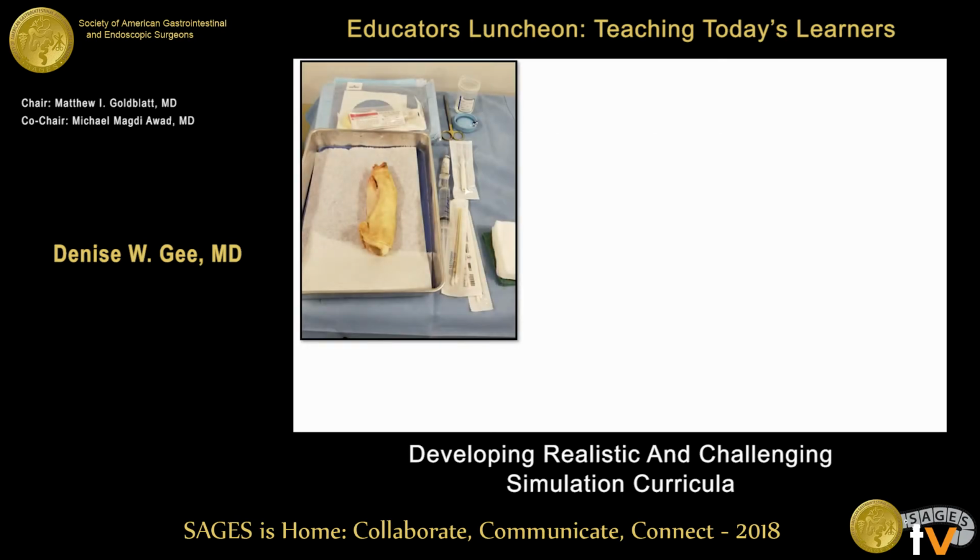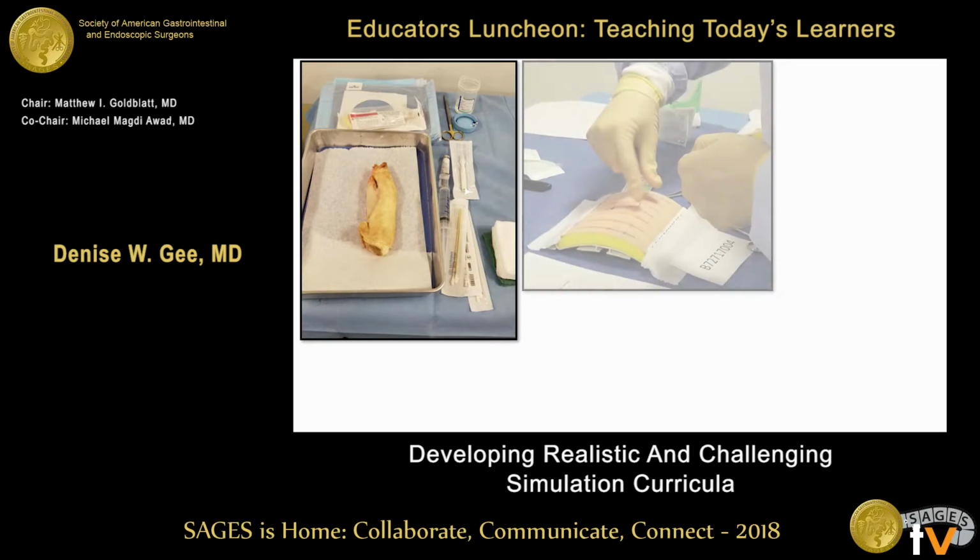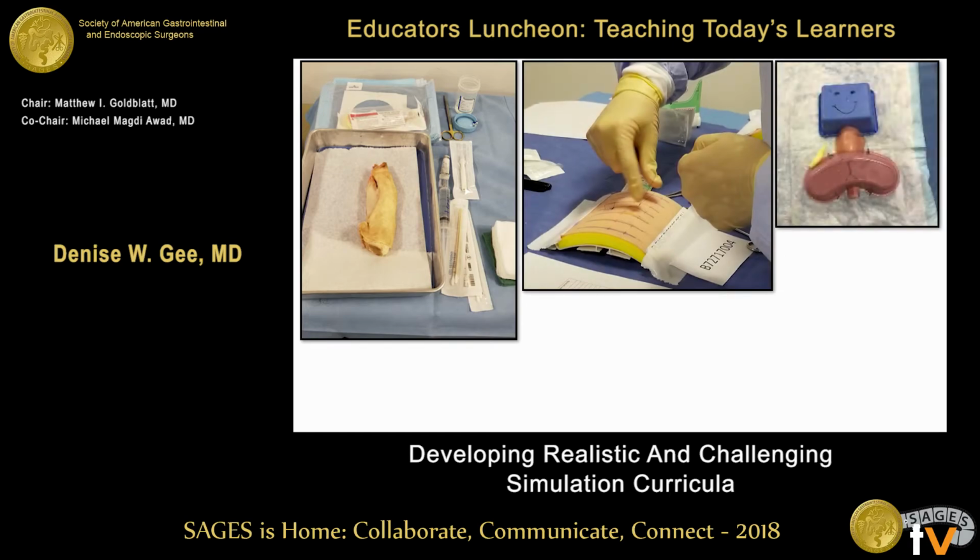And the models that we use for our PGY 1 through 3 residents are the models that are on the ACS APDS curriculum. And so they're relatively cost-effective, and they work really well. And so this is the setup for biopsy. This is for suturing.